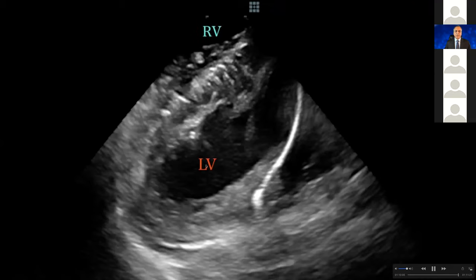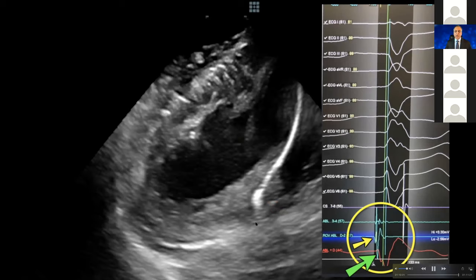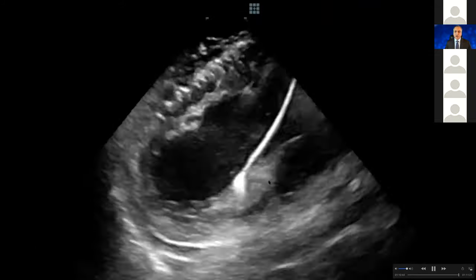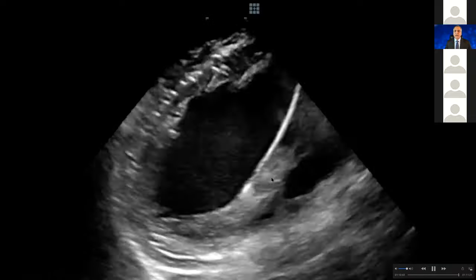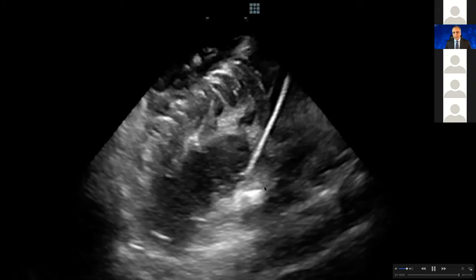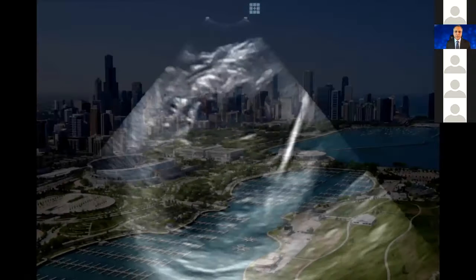This last case involves the left ventricle — the posterior medial papillary muscle — and you can see how ICE is going to help you. This is my ablation catheter in the posterior part of the posterior medial papillary muscle. The electrogram was very early, but there was a small R wave on the unipolar, so I considered whether it might be coming from inside or the other end. Ultimately I went to the other side of this papillary muscle — still the posterior medial — and was able to burn there with no R wave on the unipolar. I burned from both sides to eliminate that PVC.